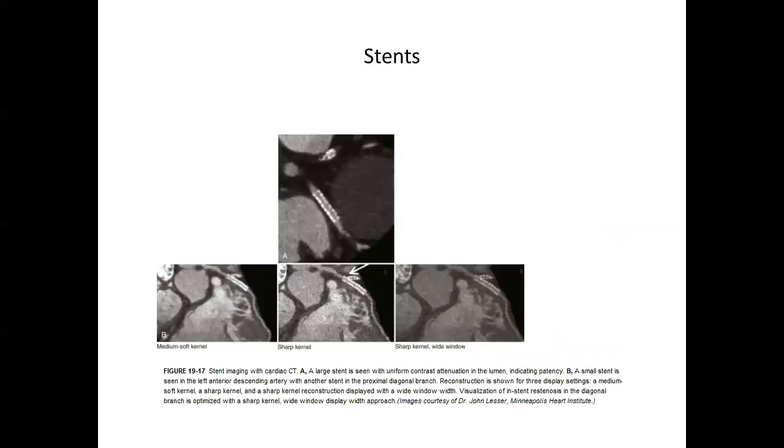Stents, if it's proximal, so if they're big stents, our cutoff is they have to be at least about 3 millimeters, then we'll do it. But as you get more and more stents, multiple stents, chances are you're not going to have a good CT. For left main, I think the trial XL or whichever one was going on, this was part of the protocol. So left main stents, this is well accepted, it works well.